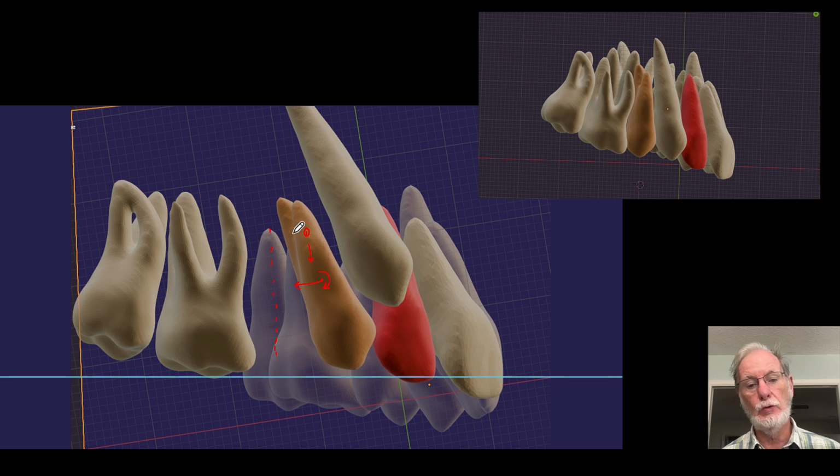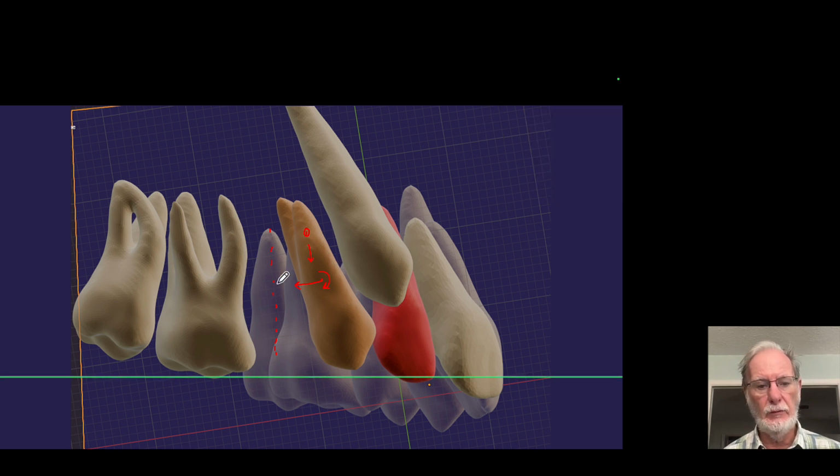But we are also aware as orthodontists that this force system will be found if, assuming I am pulling from this molar, there is action and reaction, action being here and reaction being there. So this molar will feel the same force in the opposite direction and will also have a moment in the other direction.